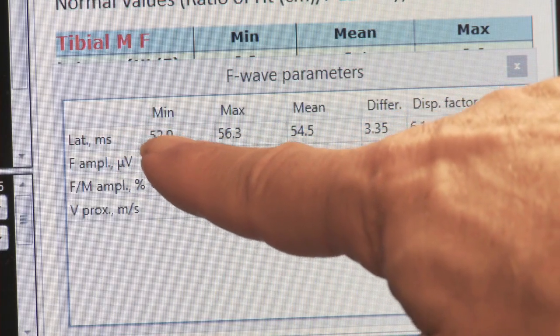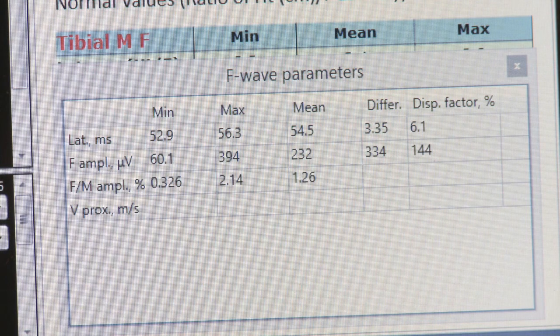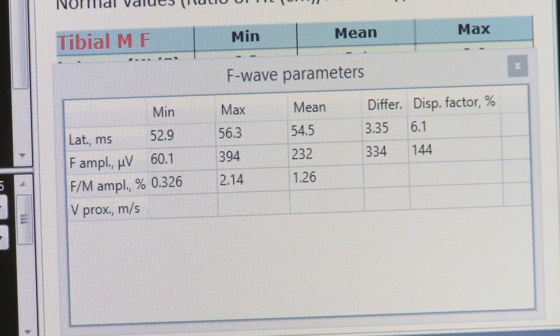The screen is going to show you the minimum F wave, the maximum, and the mean F wave. That's the end of the study for the tibial F wave.